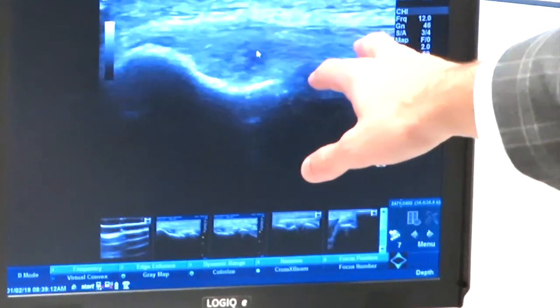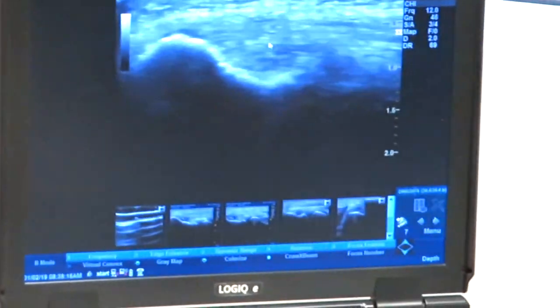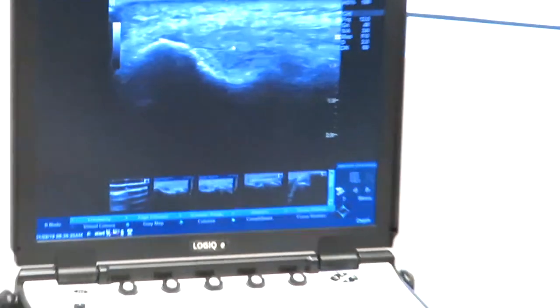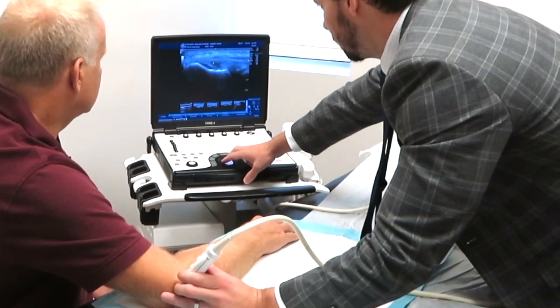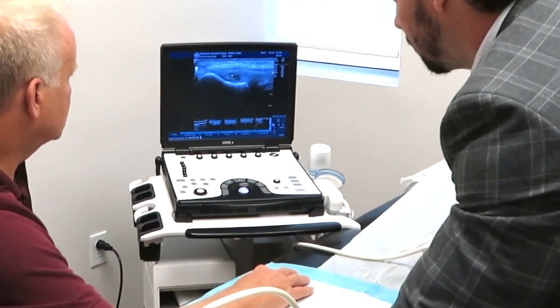The tendon is supposed to be a nice fibrillar structure that goes in and attaches into the bony structure of the lateral epicondyle — and there it looks normal. Now I'm going to move right on top of where the tear is at. And we start to notice, right around there, a loss of homogeneity of the tendon, which is consistent with tendinopathy and partial tear.